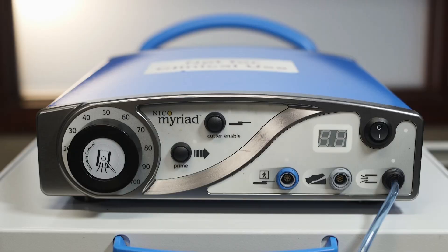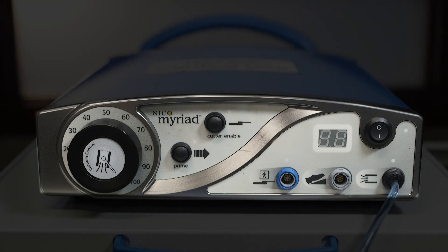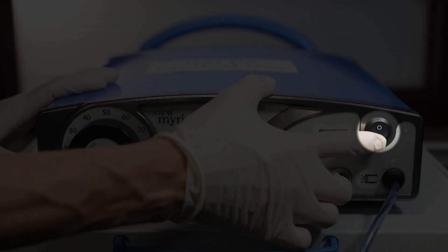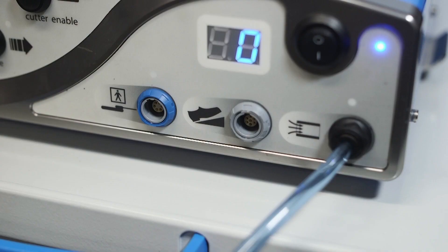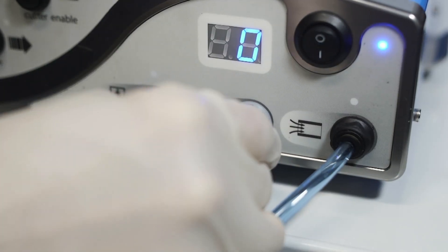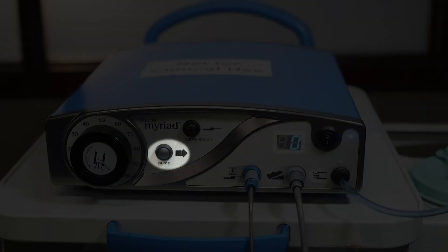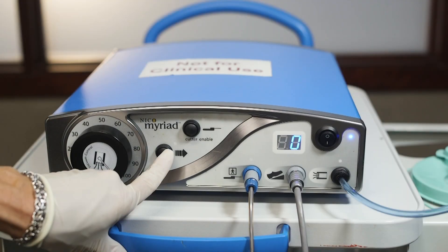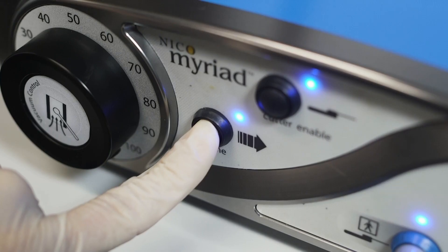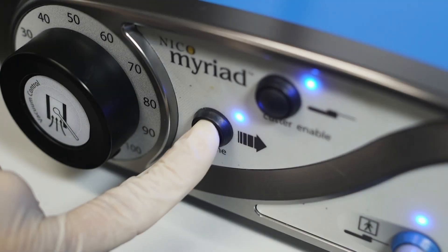Operating the NICO Myriad can be found by using the functions located on the front panel of the console. To turn the system on or off, toggle the power switch to the appropriate indicated position. The foot pedal image shows the attachment site for the foot pedal cord to the console. The Prime button enables the user to prime the handpiece. Priming will occur as long as this button is depressed. The indicator light, located above the Prime button, illuminates when the handpiece is being primed.